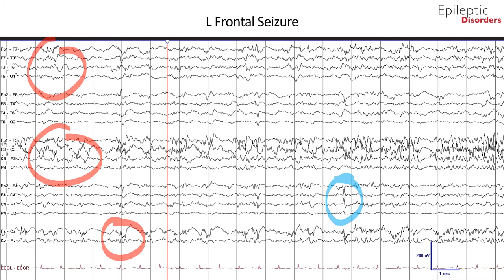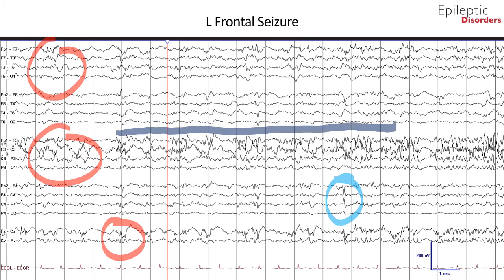As the sharp wave activity progresses throughout the page, there is evolution in morphology, frequency, and amplitude—initially starting at one cycle per second and then gradually increasing to four cycles per second, as noted by the dark blue circle and arrow.